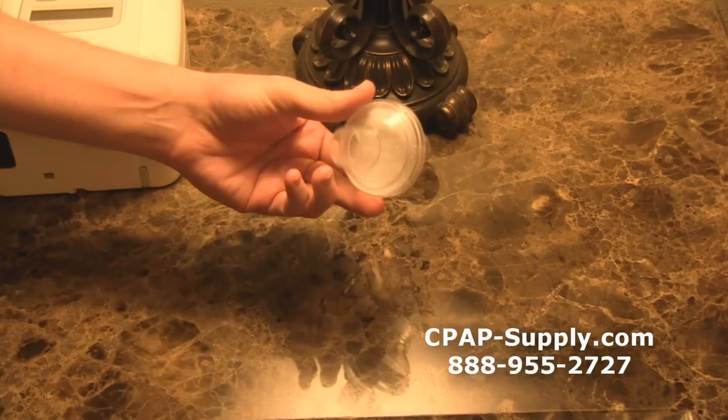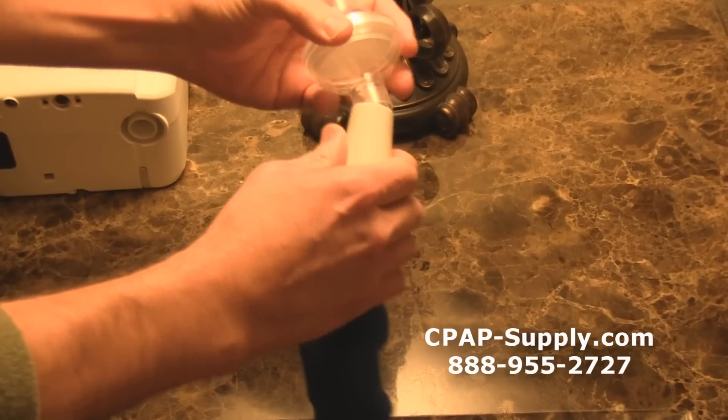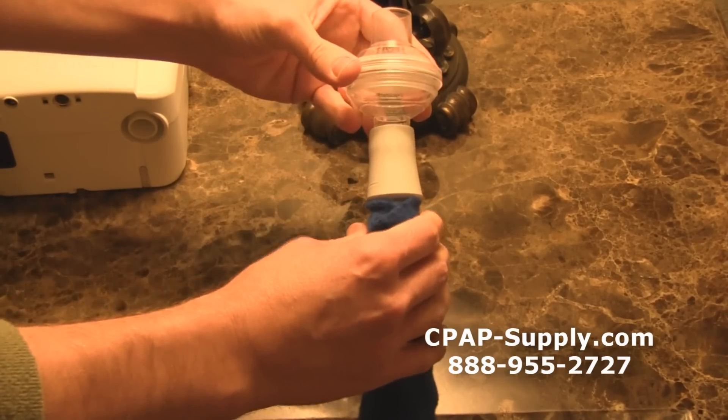This is the bacteria filter for CPAP machines. The bacteria filter is an optional filter that can be added to the air outlet port on your CPAP machine or humidifier, and it's designed to filter bacteria without reducing pressure from the CPAP machine.